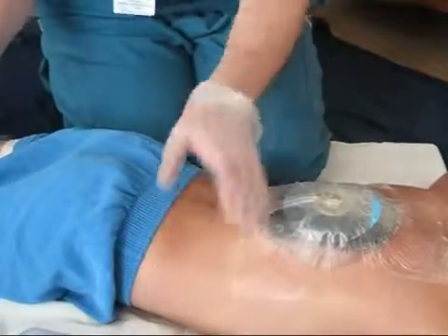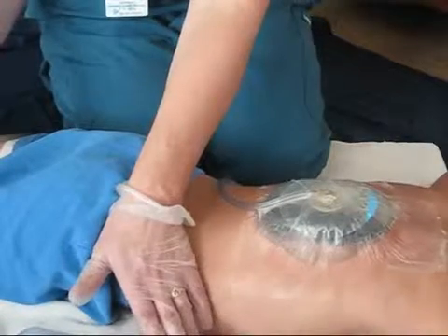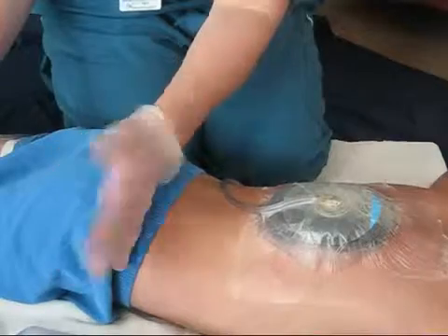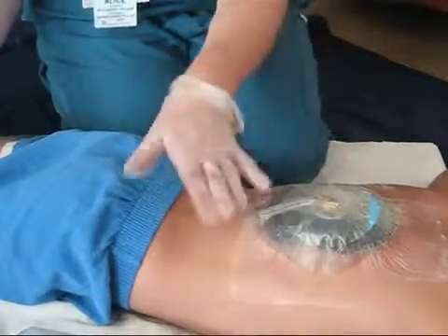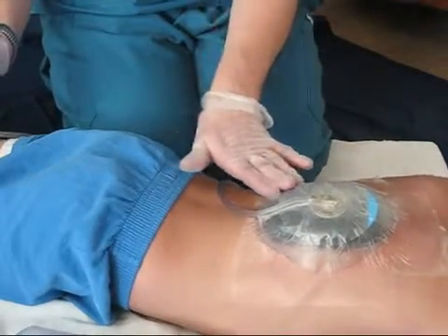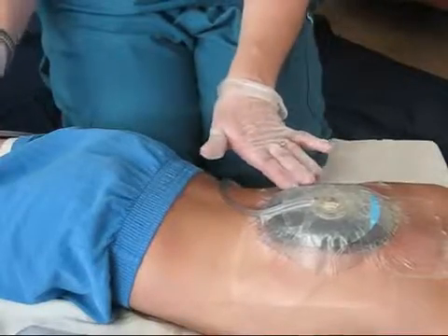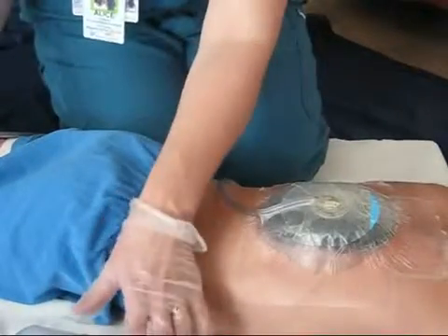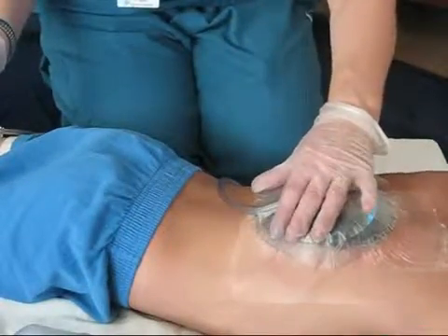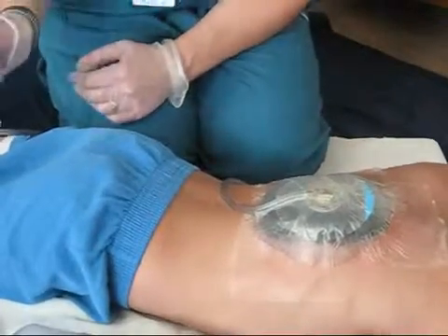Once the tubing has been connected, turn the power on to the negative pressure system. If you hear a loud sound, then there's a leak, and you'll want to place as much drape as you need to seal off any leak. You can listen with your ear to see where you hear any air leakage. Once it's been sealed off properly, you won't hear the sound of the motor anymore.